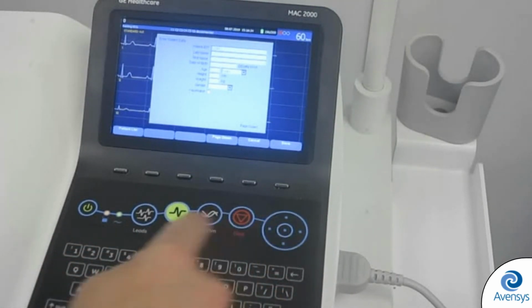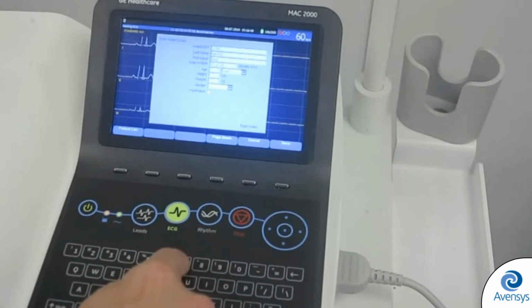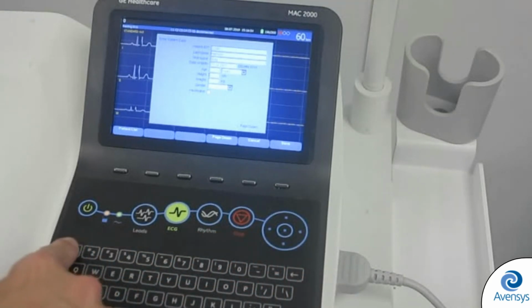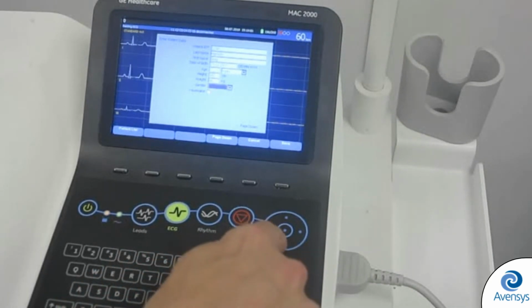Enter the patient ID using the numeric keypad. The trim pad or enter key is used to navigate through the data fields. For drop-down menus such as the gender field, ensure the data field is highlighted, then press the display key on the keypad to display the list of choices. Use the trim pad to navigate the list. Select the option by pressing the center key. To select radial button options, highlight the data field and use the center key to select or deselect.